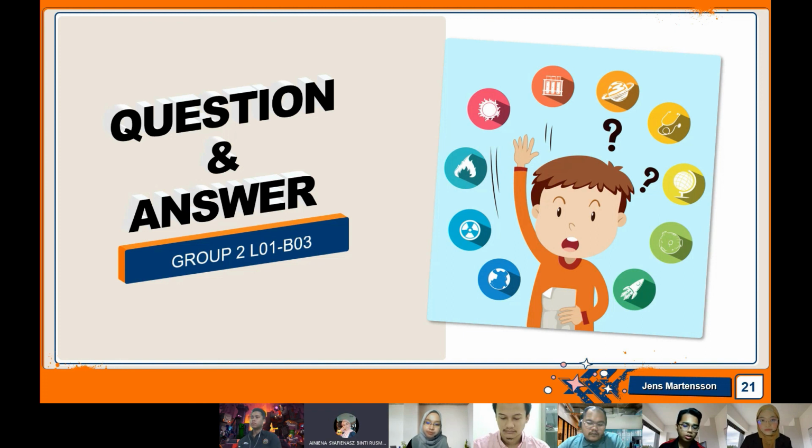Thank you for the question. Based on the question, what happens when the quench button is being pushed? Pushing the quench button will cause the liquid helium that cools the magnet to rapidly boil off. The quench pipe above the magnet is designed to allow the helium to vent outside of the building. If the quench pipe fails, there is a danger that the magnet room will be filled with helium and that the oxygen in the room will be displaced, which could cause injury or death for anybody in the magnet room or the console room during a quench.